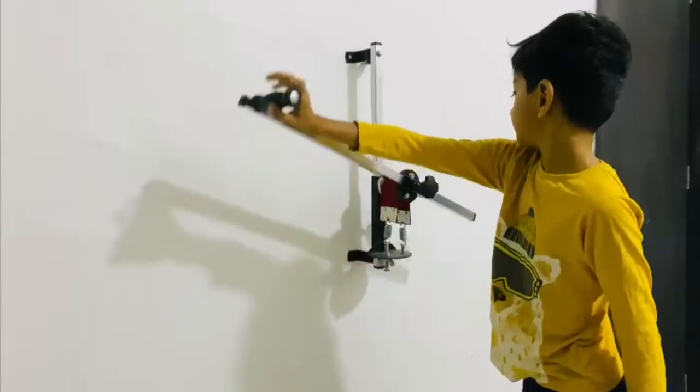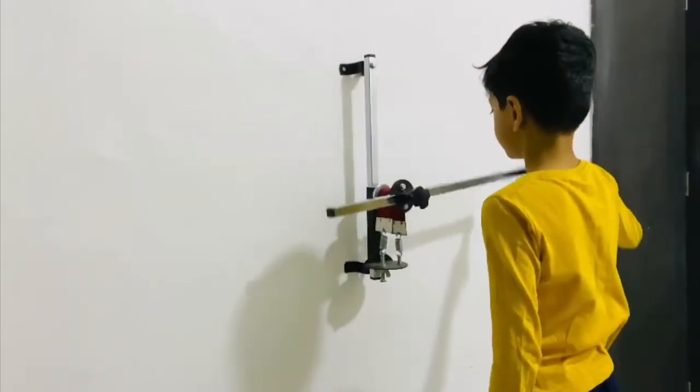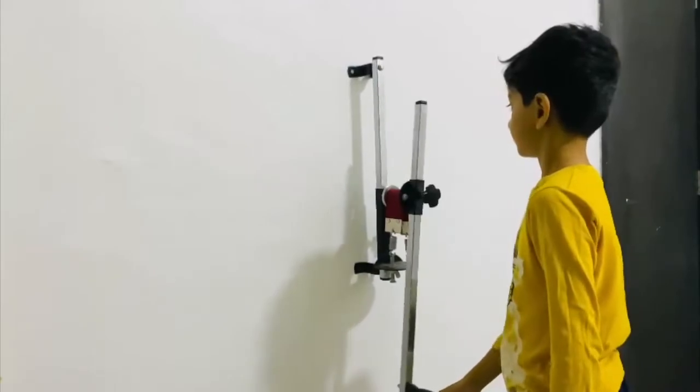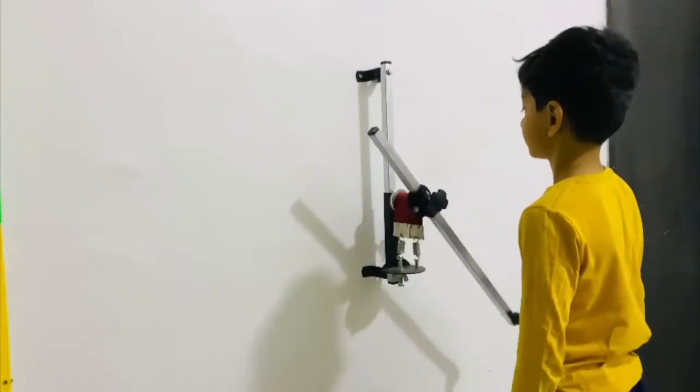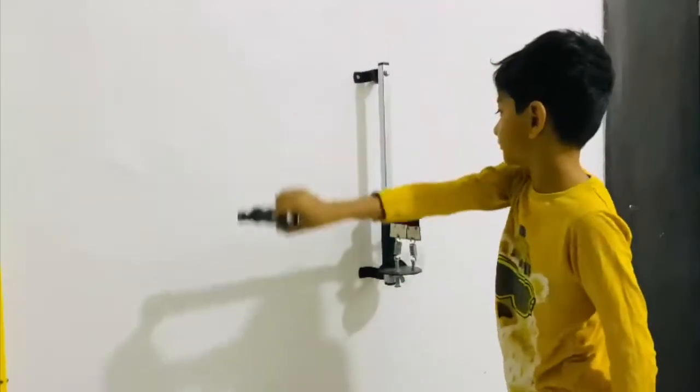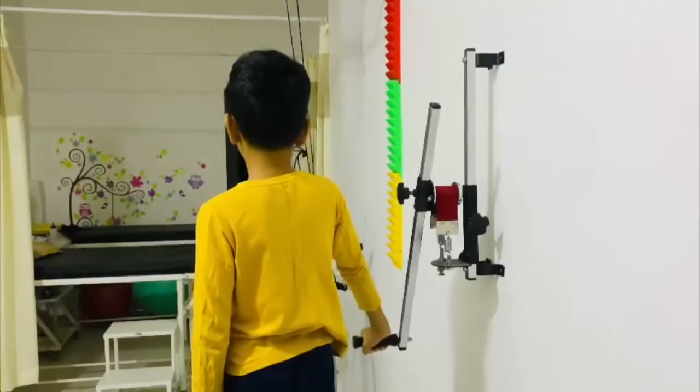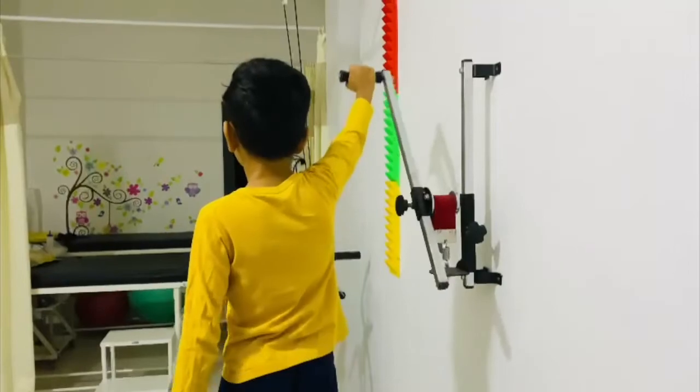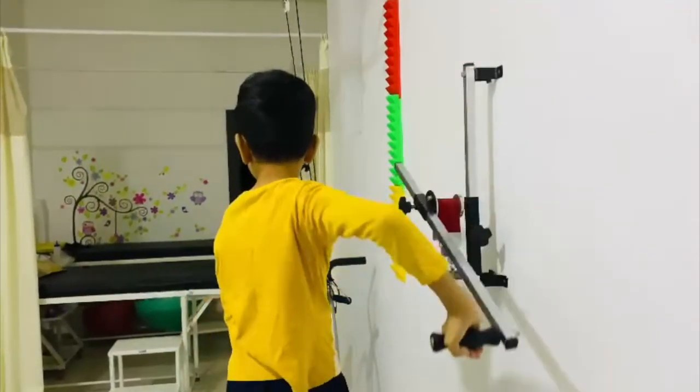Grab the handle and move the shoulder wheel or shoulder bar in clockwise and anticlockwise directions, 15 times each. In another method, the patient can stand with the painful shoulder facing toward the shoulder wheel.